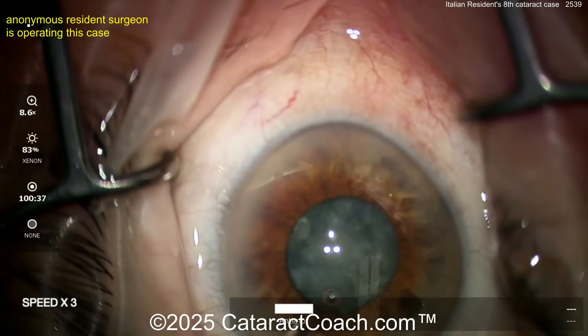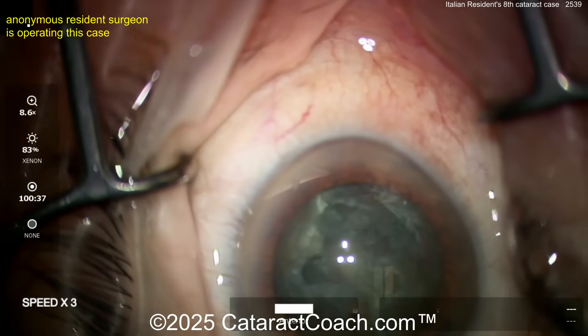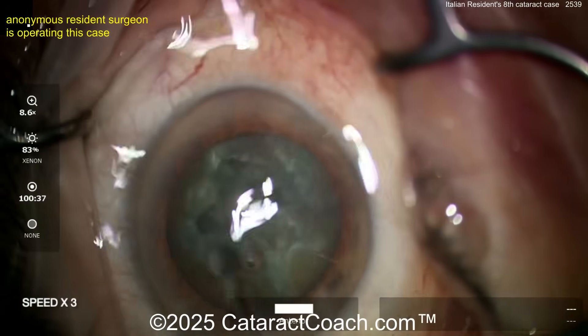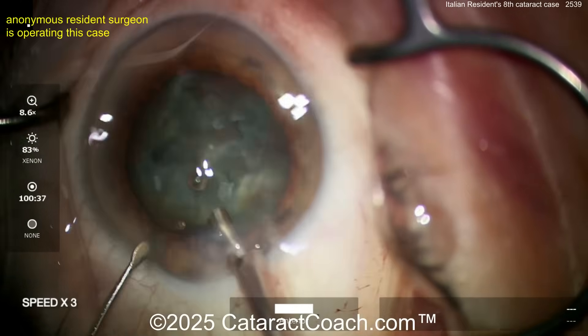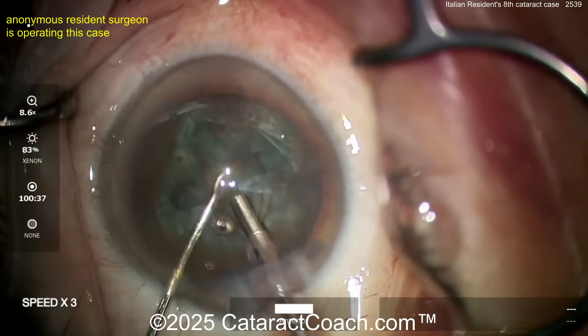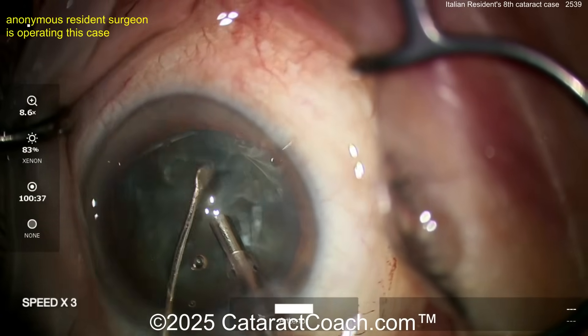The pupil is coming down — a little bit tough. Let's see what you're going to do here. More viscoelastic perhaps. Get the probe back in the eye. This is pretty good. Again, this video is edited to about seven minutes, so if there's three times the normal speed, the video is about 20 minutes long. That's pretty darn good for case eight.